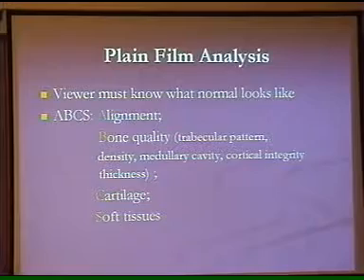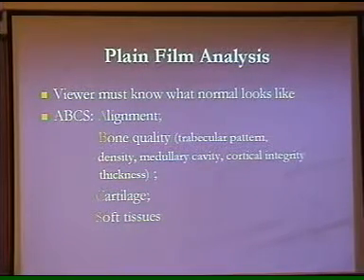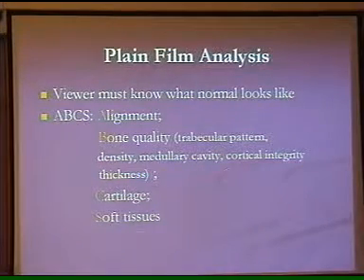But in cases of inflammations or acute osteomyelitis, because of the edema and the massive production of fluid, this fascial plane is lost. So please, you have to be very careful.